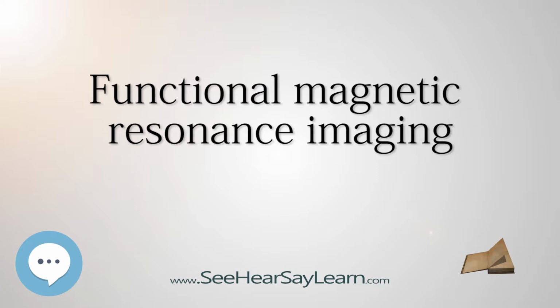The physiological blood flow response largely decides the temporal sensitivity in BOLD fMRI, that is, how accurately we can measure when neurons are active. The basic time resolution parameter, sampling time, is designated TR. The TR dictates how often a particular brain slice is excited and allowed to lose its magnetization. TRs could vary from the very short, 500 milliseconds, to the very long, 3 seconds.